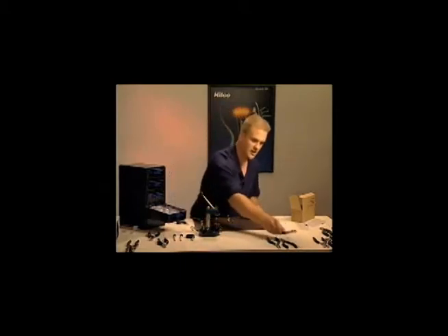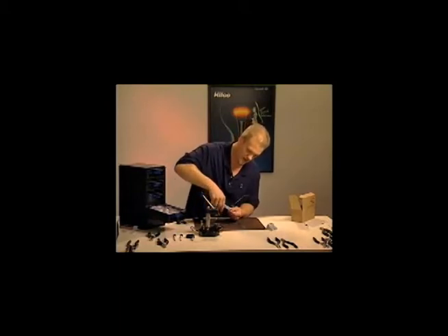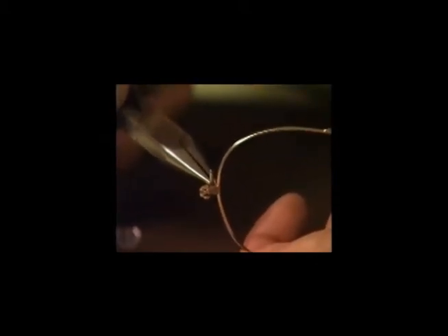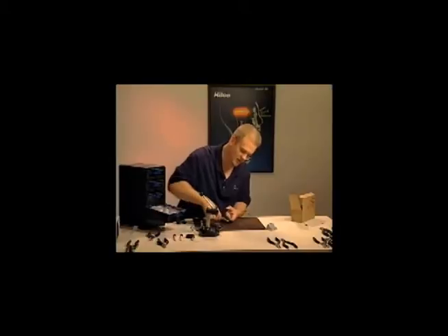Now I'm going to use an Ergo Pro plier, the chain nose. This I find is the best tool to snap off the excess of the stainless steel repair screw. And what you want to do is grab the screw as close to the bottom as possible and then twist it. It'll break within 1 or 2 twists. You can twist it back and forth. It broke right on the first try, broke off nice and clean.